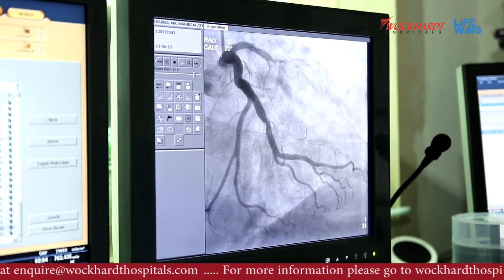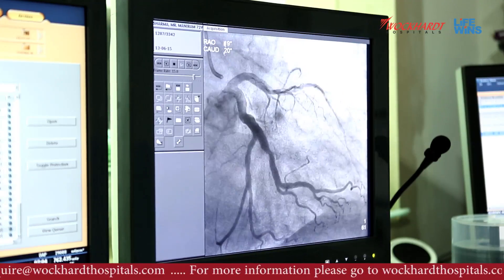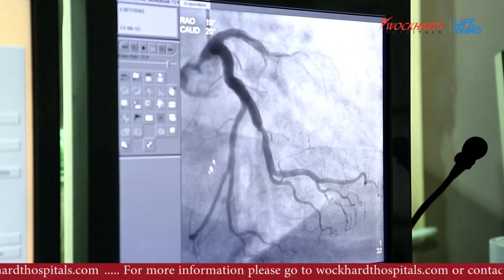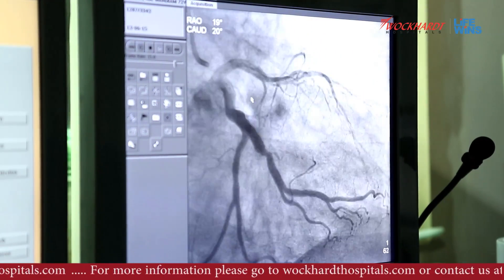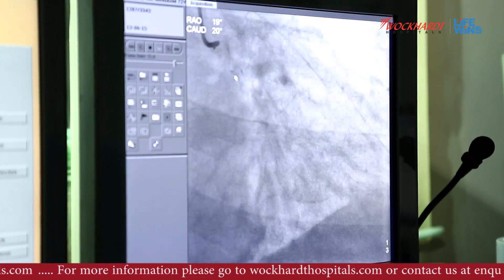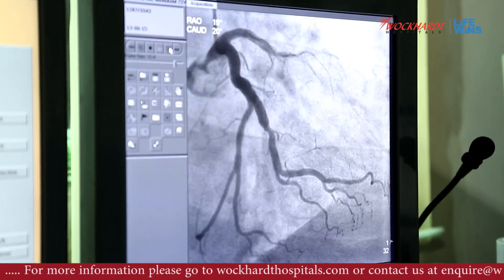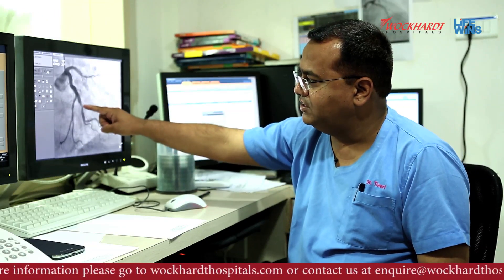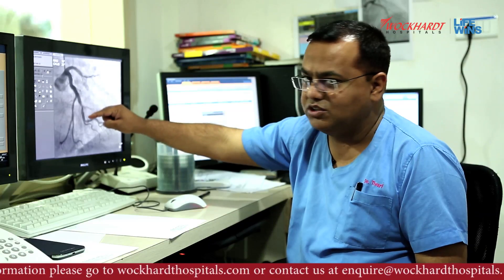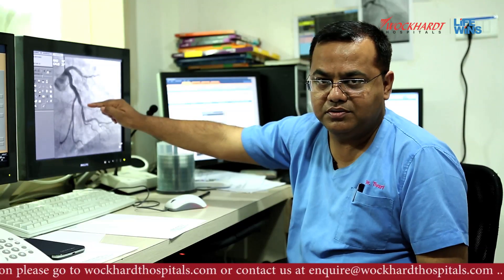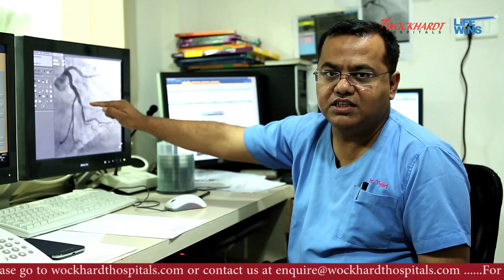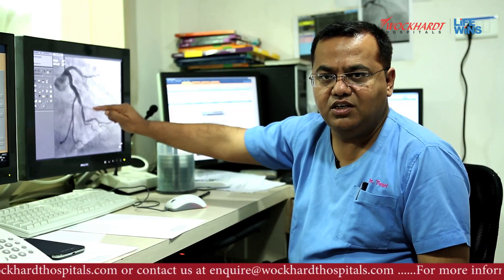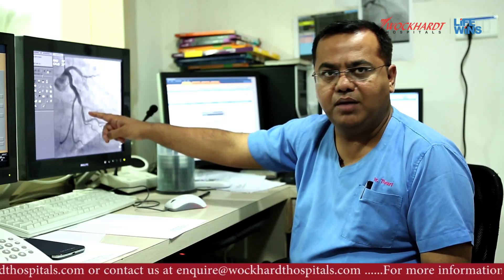This is the coronary angiogram. This is the catheter — a two millimeter diameter pipe through which we inject the contrast. The black colored thing you see is the contrast. Out of the three arteries, this is the circumflex coronary artery. This area is normal, this area is normal, but this area is slightly narrower — around 40% blockage. Such blockages can be managed medically only; there is no need for angioplasty or bypass.